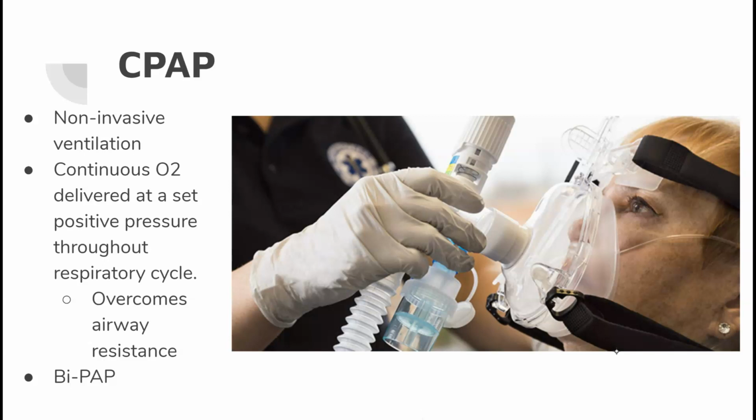While it's a really good setup, it can cause some complications in terms of mask seal. So just something to keep in mind. It's super helpful to help monitor your patient if you are able to rig it up and have that side stream available to yourself. BiPAP is two levels.